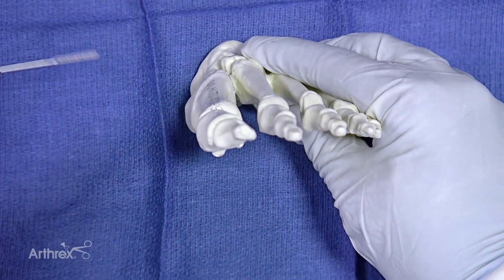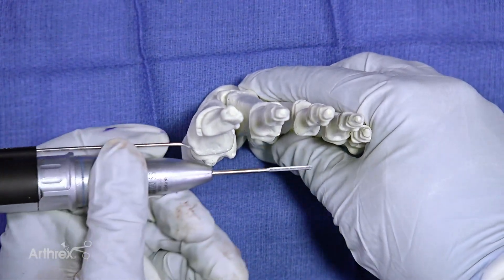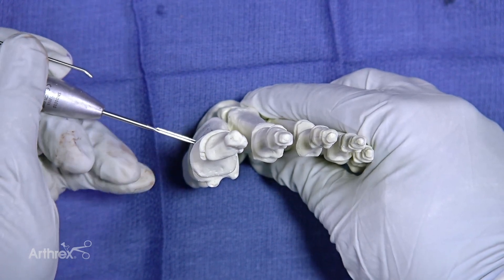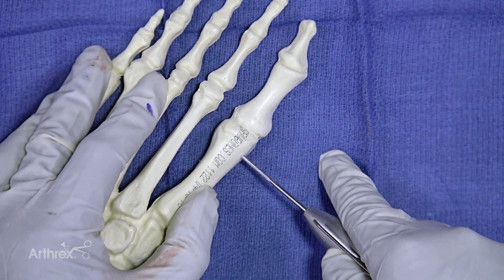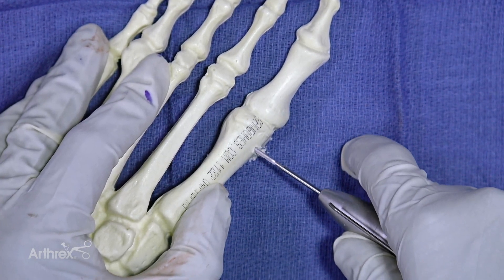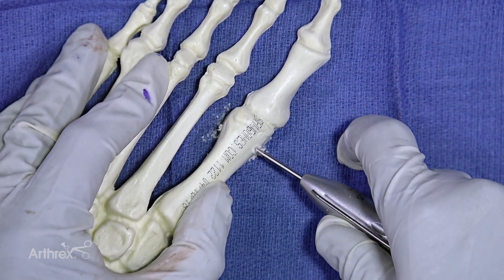It's also important from an axial perspective to note that this cut is not going to go straight across or parallel to the weight-bearing surface of the foot. It's going to be directed a little bit plantarly, 10 to 20 degrees in that plane. I'm going to direct it a little bit distally to make up for our bone loss, and the first maneuver is going to go straight across. We're going to see the burr exit out the lateral cortex of the metatarsal head — you can see it right there.